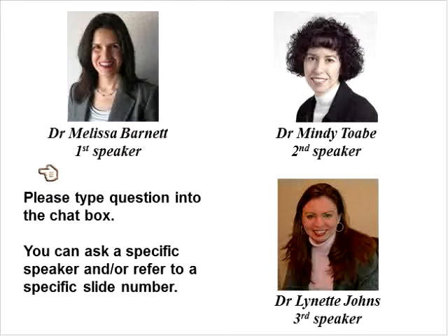This participant says, I find it very difficult to evaluate the fluorescein tear layer on follow-up when so little fluorescein reaches the apex of the lens. Any suggestions? How about Melissa? What I like to do is just gently press on the conjunctiva with my finger to try and get some fluorescein up under the lens, both inferiorly and superiorly. I find that that's helpful.